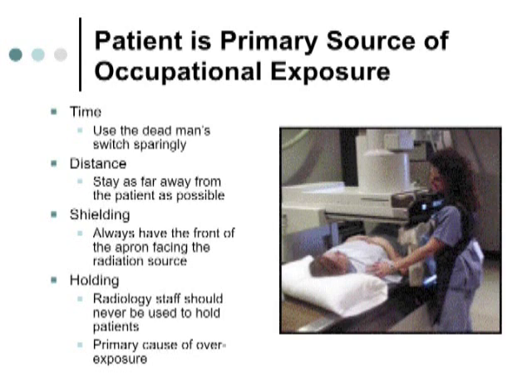Okay, all x-ray machines have something called a dead man switch. Does anybody know what a dead man switch is? Yeah. Students love this question on exams. They say, oh, it's a switch that, you know, after you stand there, the patient dropped dead. You drop dead, it goes on. Right. It's a switch that requires manual activation, pressure to activate it.